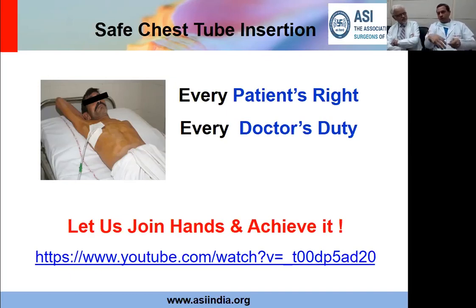So first you explain to the patient that you have to take a deep breath in and hold, and then you pull out the chest tube. What I do is a maneuver of moving the chest tube and see that the patient does not start breathing. Many times, the moment they have pain, they'll start breathing. So you have to tell them, please don't breathe, otherwise there'll be a problem. So you tighten the stitch as the chest tube is being pulled out.